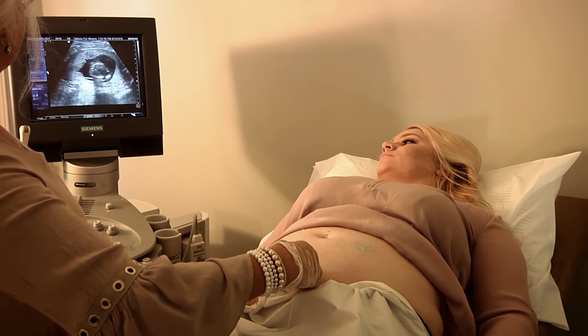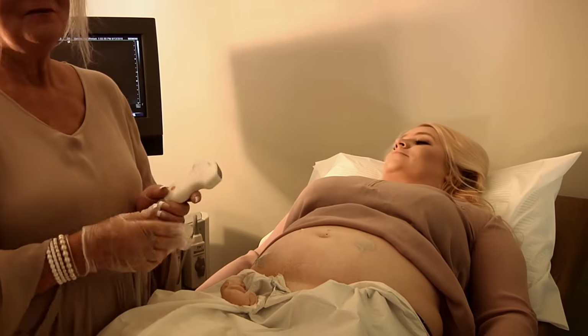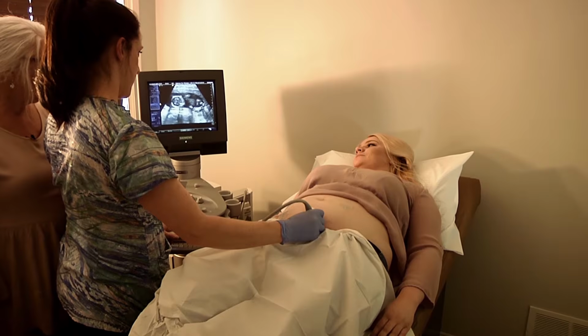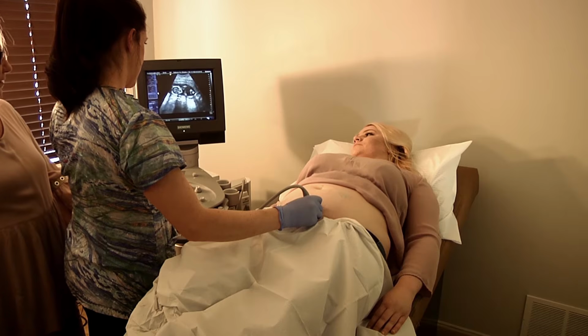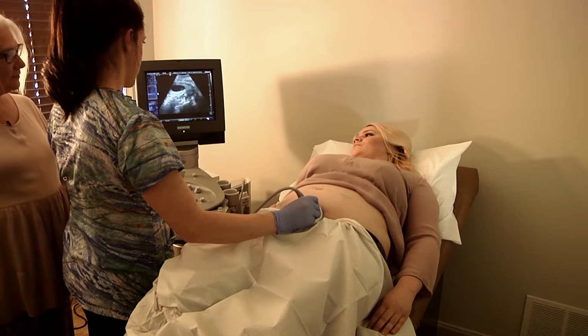There's your heart. And down here is your femur. So, who wants to start? Okay, she's starting sagittal, so let's get this back to the beginning. Okay. So go ahead and bring your depth all the way down, the other way. Perfect.